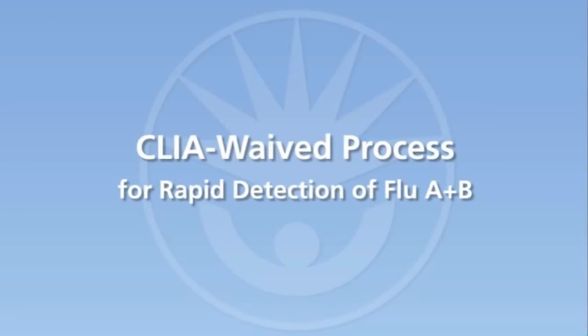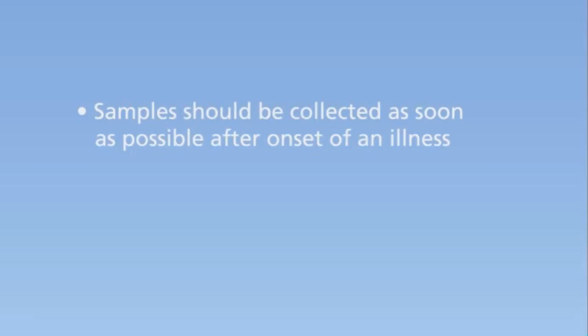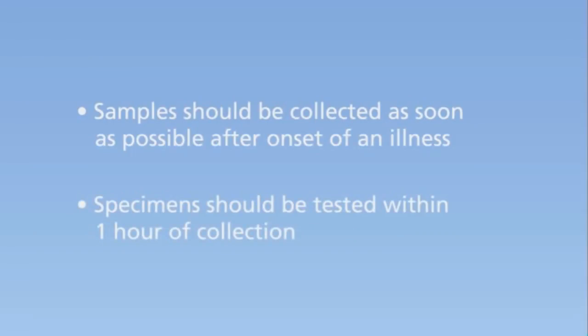The process begins with a properly collected sample. Samples should be collected as soon as possible after onset of illness and tested immediately. For a review of proper sample collection technique, view the sample collection tutorials. Let's review the components you will need for testing.